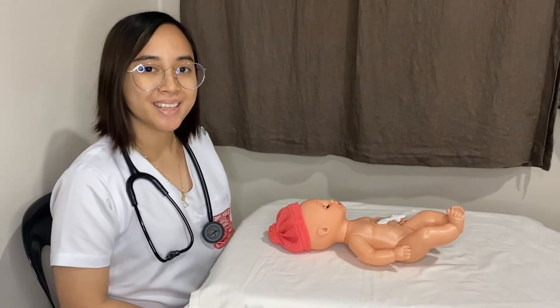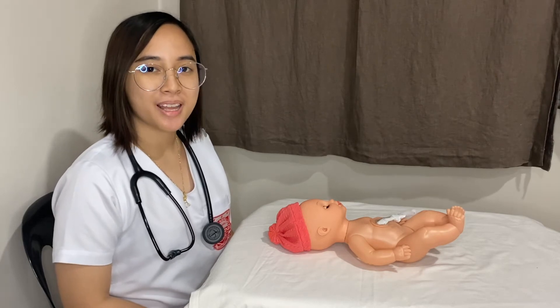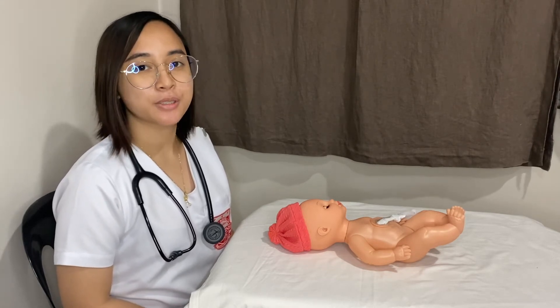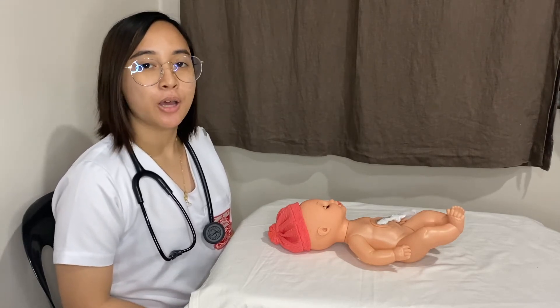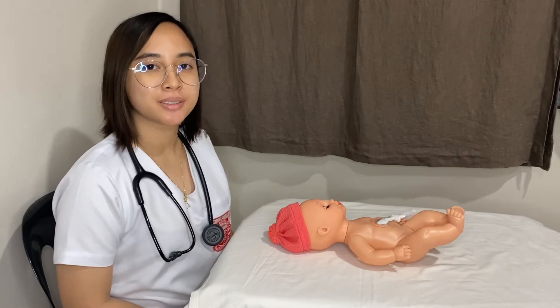Good day! I'm Dr. Tassalonay Capriela. Today, I will be demonstrating how to do lumbar puncture.